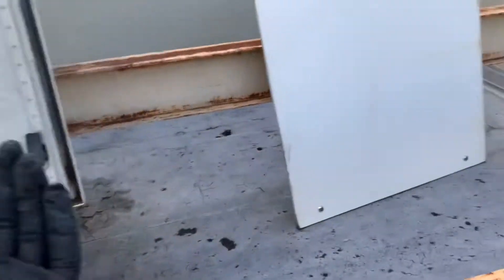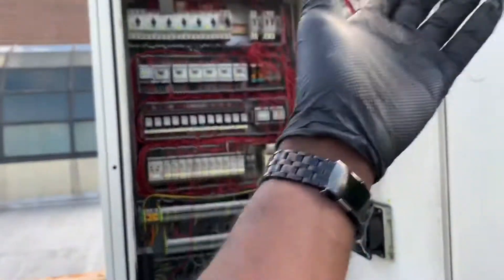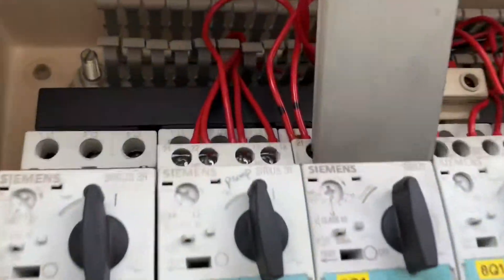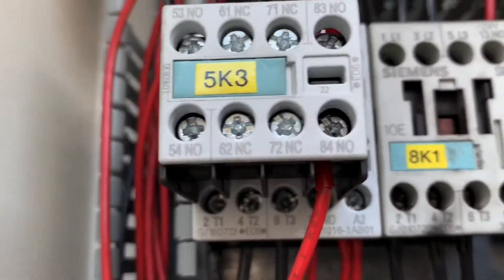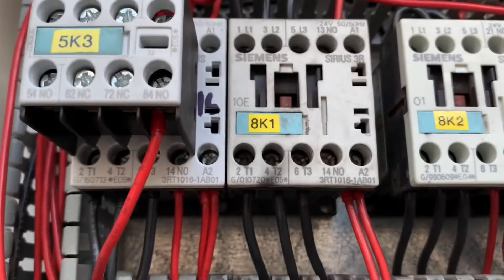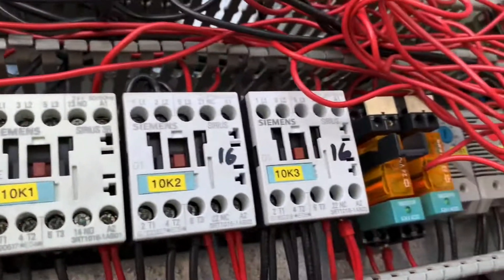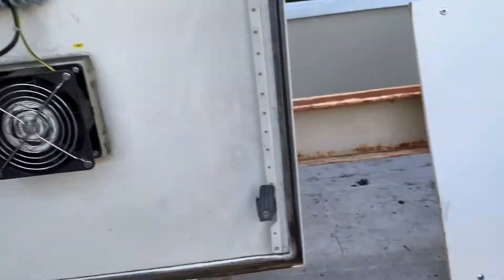So this chiller cools down that cold head compressor unit. Without this, business can't go on — they can't do any scans. And it's in such poor condition. We've got burnt overloads here. These are fan contactors — two-speed fans — both fans are supposed to run simultaneously, but one is bad and the other side isn't on because the compressor is flat, no refrigerant.